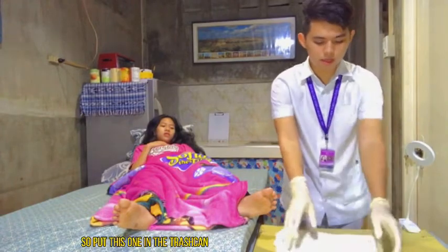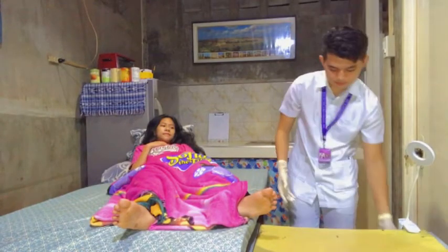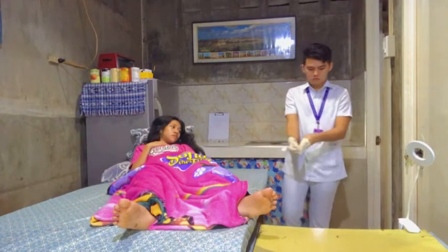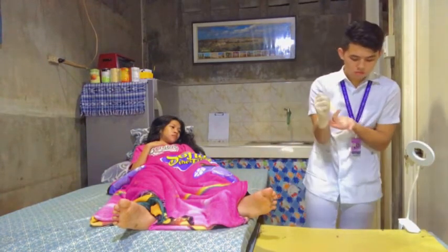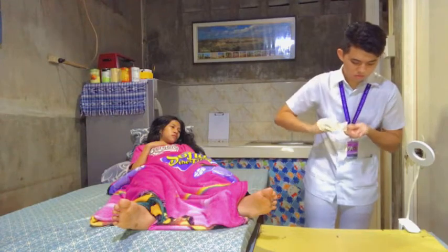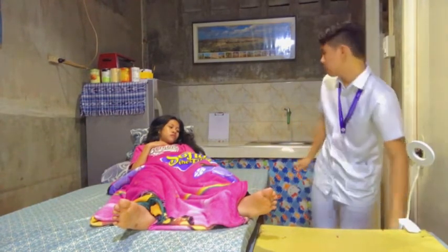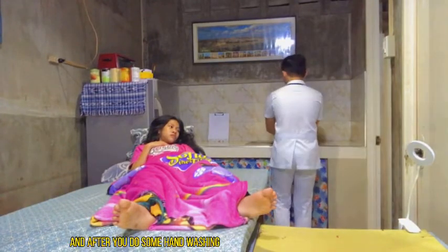So put this one in the trash can. And after, do some hand washing.